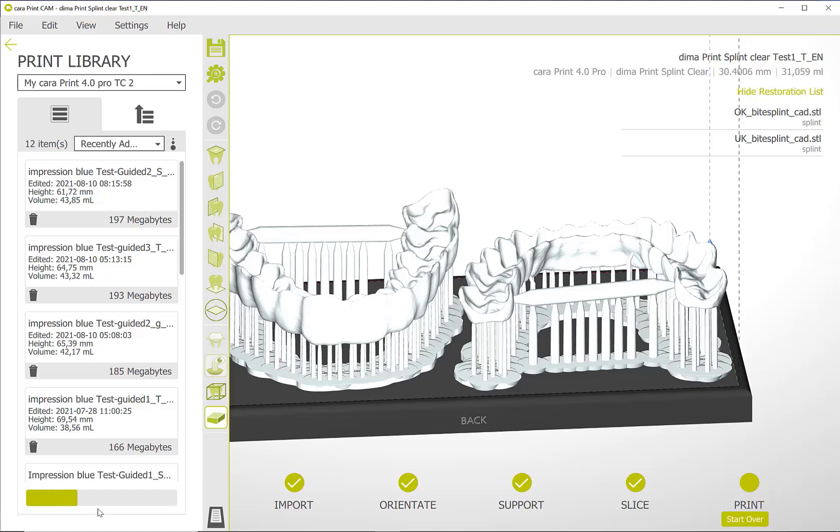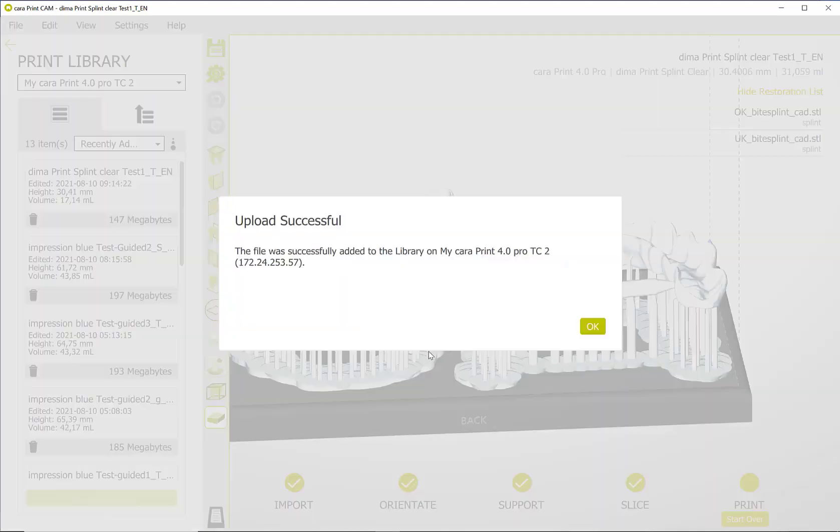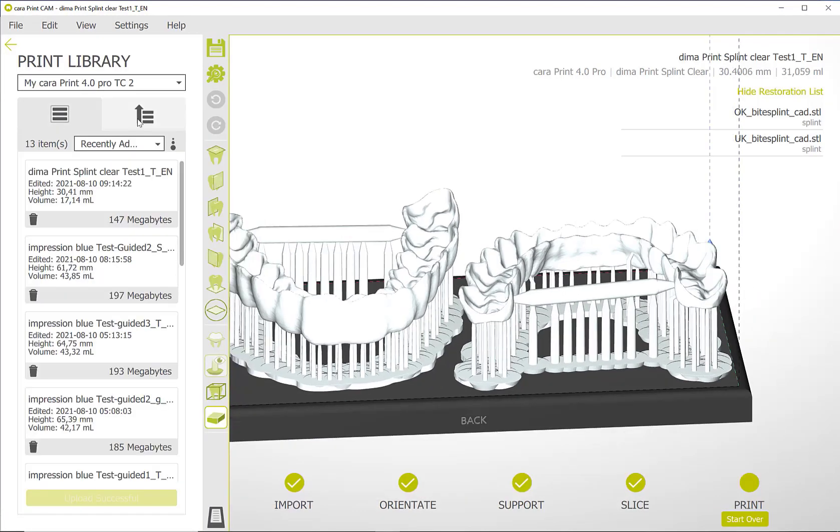After the transfer, the print job is available in the printer's library and can be started. In another video, we show you the individual use of the Kara Print Cam 2.0 software.